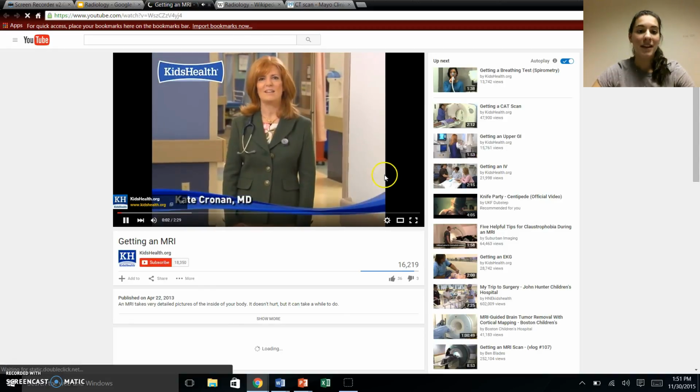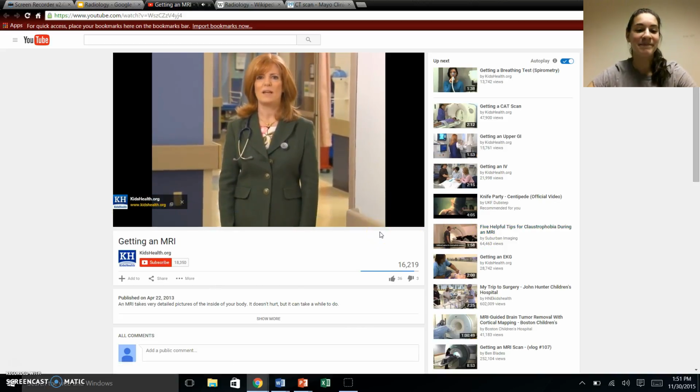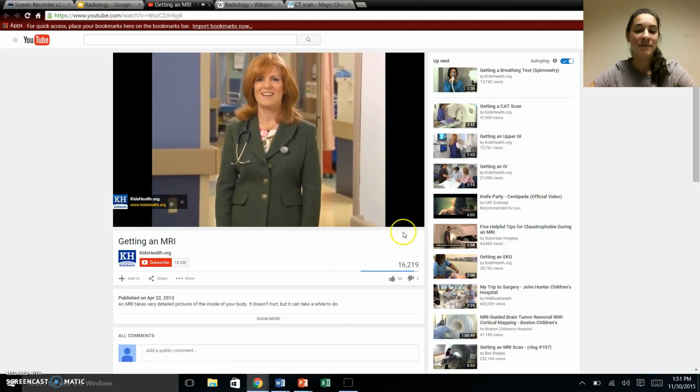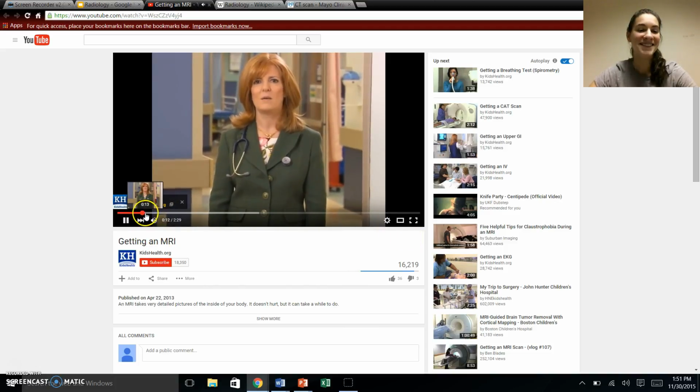Hi, I'm Dr. Kate. So, you need an MRI. MRI stands for Magnetic Resonance Imaging. Like X-rays, MRIs take pictures of the inside of your body, but they're more detailed.